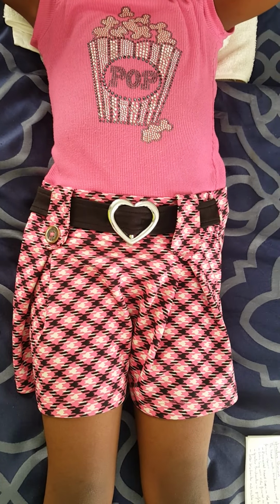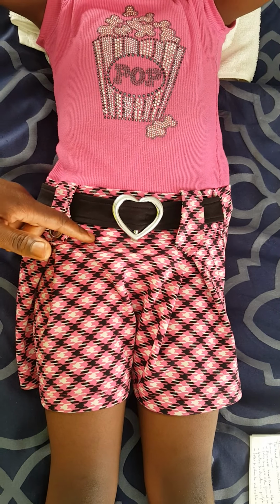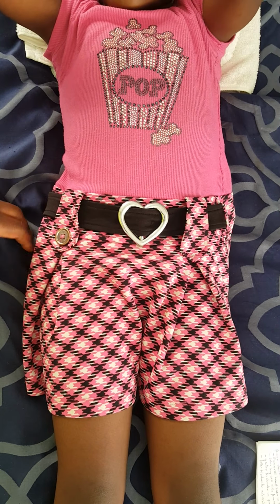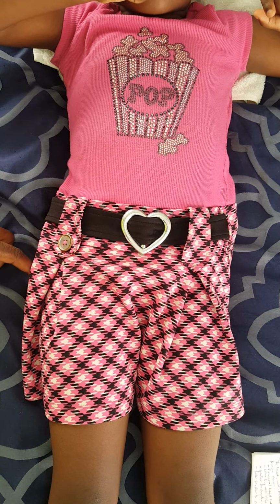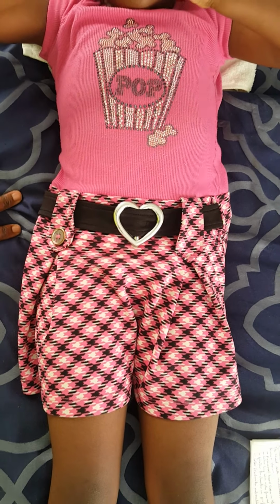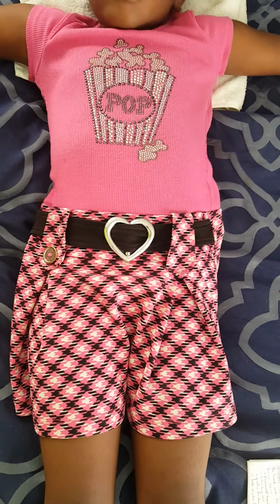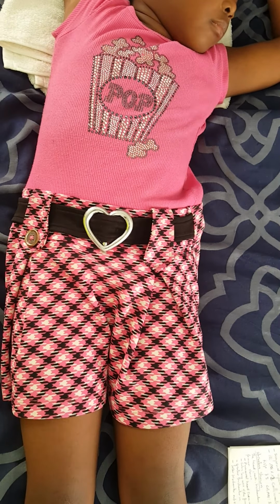The structures that will be shown here are the head, the neck of the femur. We also see the greater trochanter in profile, and the proximal femur is also shown. The femoral head is seen inside the acetabulum. We will see the entire long axis of the femoral neck, not foreshortened, and the greater trochanter, like I said before, in profile.